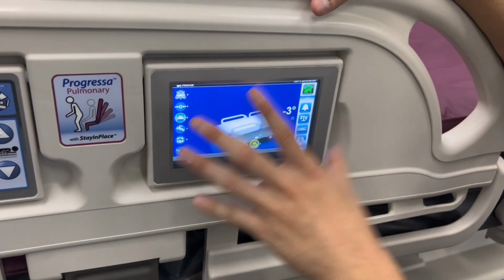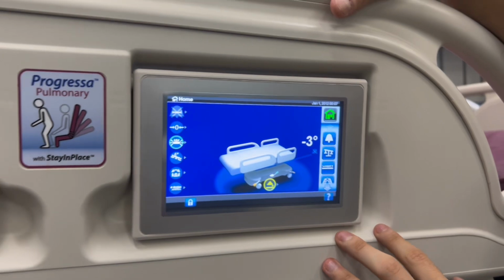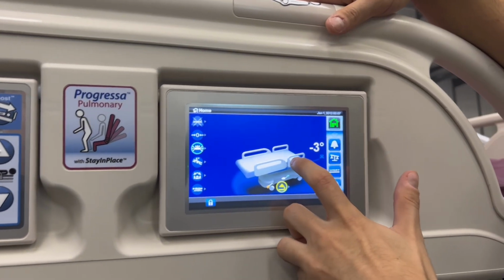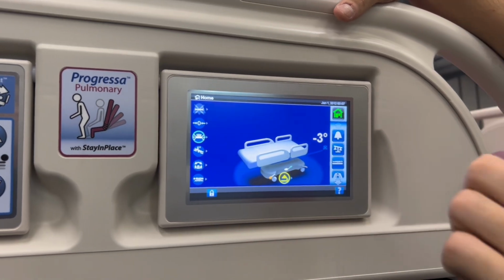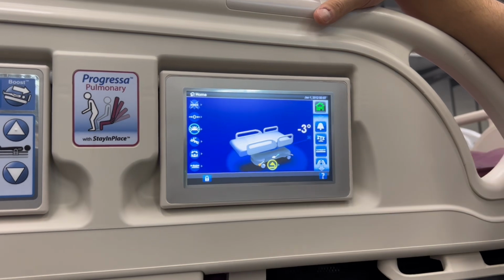Now we're going to dive into the digital screen on the device here. So for this Progressa bed, our digital screen is able to tell us almost all of our functions. So right now, we don't have the head raised at all. We don't have the knees raised at all, but we are on a slight tilt back. That's what this -3 is. So we're slightly tilted backwards.